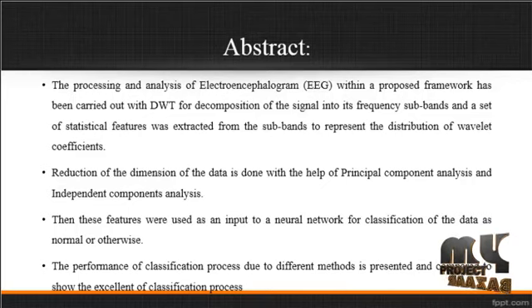Then these features were used as an input to the neural network for classification of the data as normal or otherwise abnormal. Hence, this will provide an efficient classification system for this process.